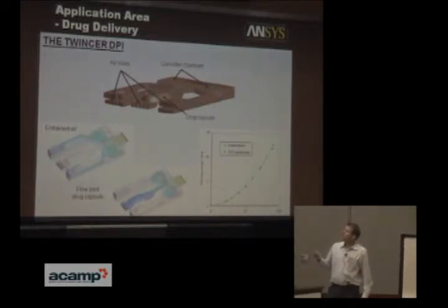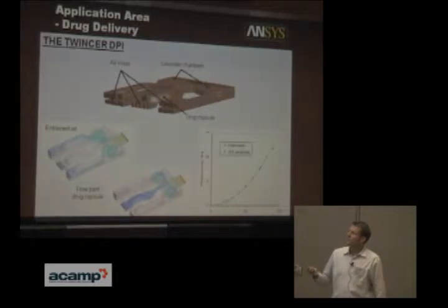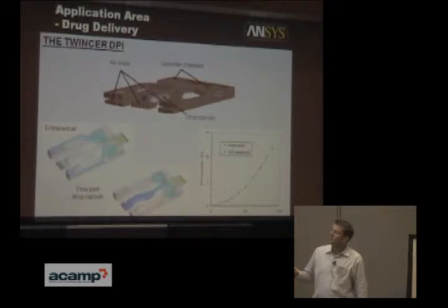You have a drug reservoir here. You place the drug inside. The patient pulls in on a mouthpiece on the other side, and that intake by the patient activates the whole system. So you see the airflow paths through the different regions of the inhaler. What we look at with the simulation is making sure there are no dead zones. We don't see dead zones in this area or anywhere. We want to see nice even flow going over the drug package, et cetera.